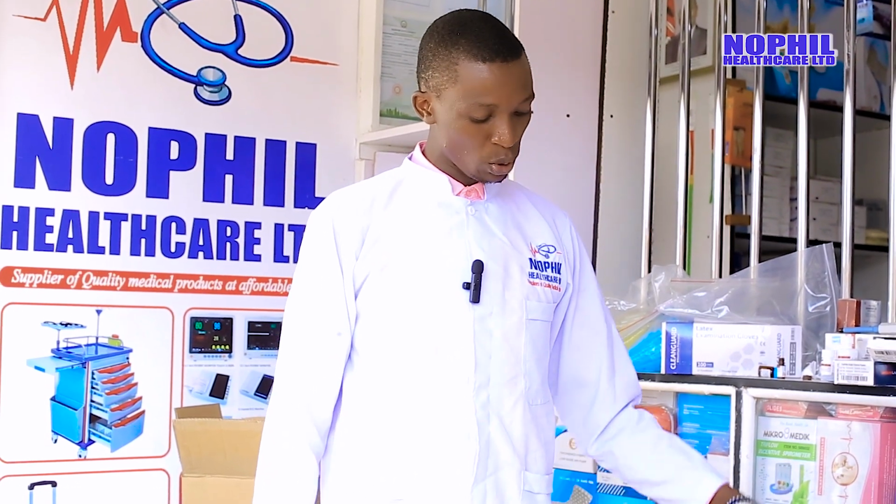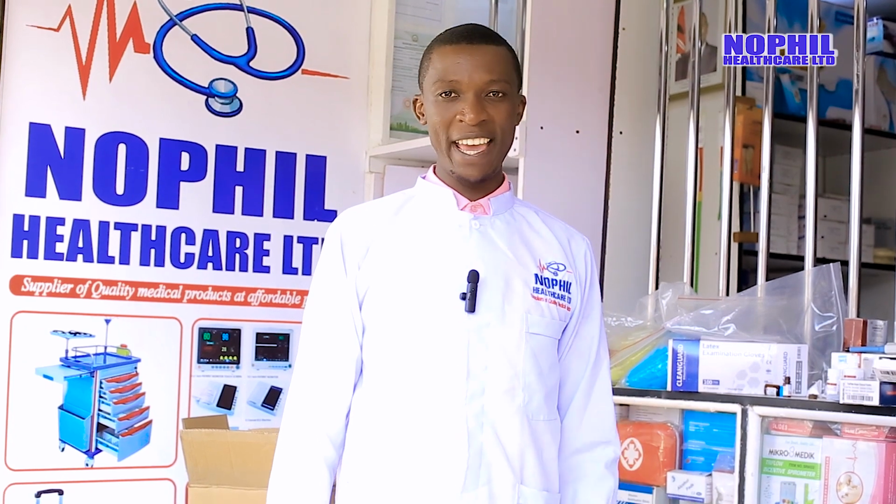For today, we had the semi-automated biochemistry machine, which is mainly used in small clinics and health centers. In the next tutorial, we will elaborate more on the fully automated biochemistry machine, which is basically used in middle and high-end hospitals to provide accurate results.